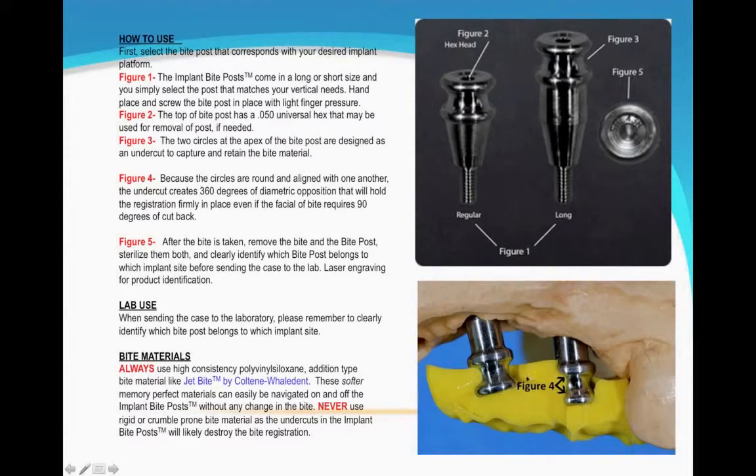You don't have to have it all. Like you'll see here, all the material didn't get in. It isn't all in there. It only has to be in a few spots. And always, I'll repeat this, don't put it underneath the lower donut. It's not necessary. It makes it hard to get out.